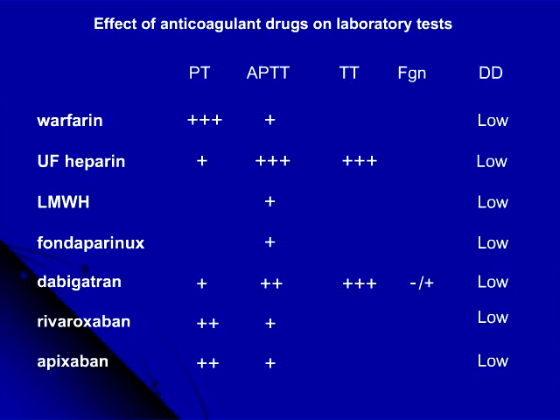And if they are aware, they're not aware of the differences in terms of the performance of reagents and tests compared to warfarin and heparin. So I think there's an enormous educational role on the part of professionals such as ourselves in the education of clinicians and clinical staff who are not actually involved in the prescription of these drugs.